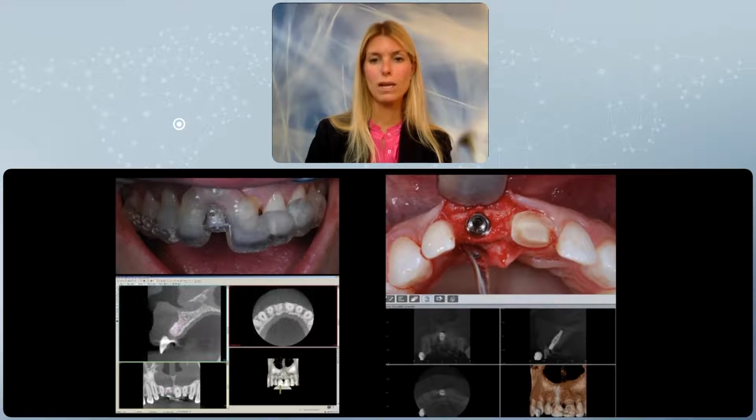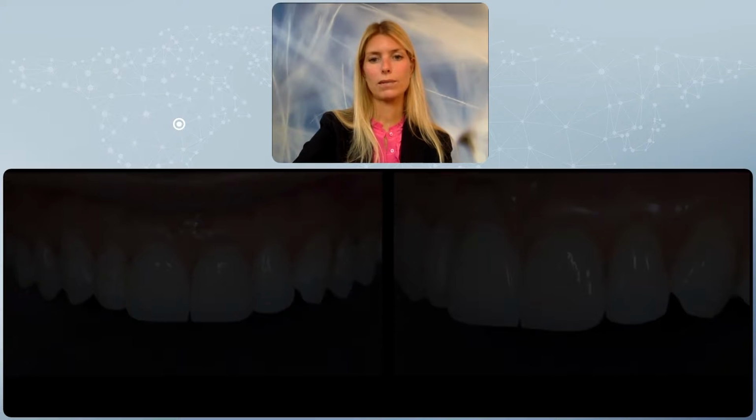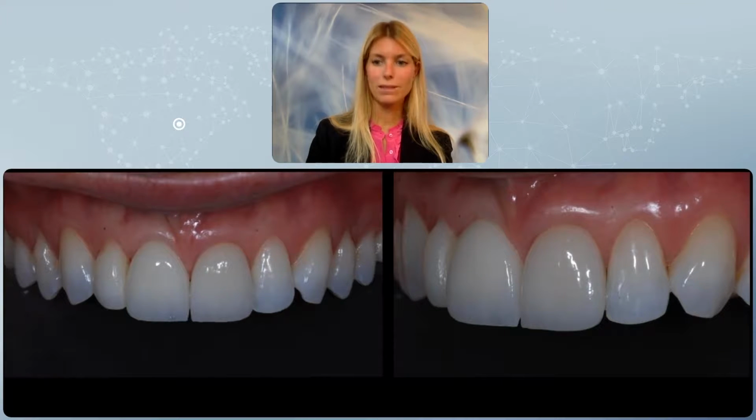makes a huge difference on the final outcome. So when the implant is positioned in the right 3D position, it is fully embedded in bone, so that's not an issue. However, because we want to improve the aesthetics and we want to achieve a very natural contour and smile, we add a connective tissue graft to be able to give that extra soft tissue volume that we're looking for. So in fact, we are following the classification where there is sufficient bone volume.